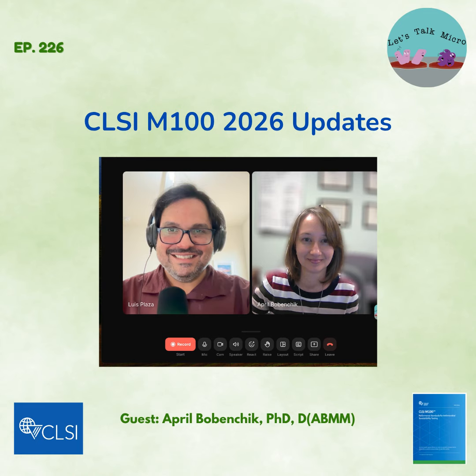And it said custom MIC panel, but I don't know what custom is. Custom because it's custom dilutions, or is it custom because it was frozen? And so I don't know. Luckily, our MICs were quite low, what we would expect in this patient, but nothing to use to interpret them. And then again, we lost the ECVs this year, which was fine because we don't want to be using our ECVs to make clinical determinations anyway.